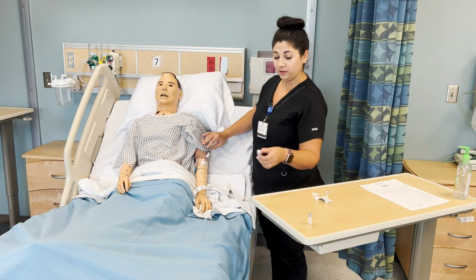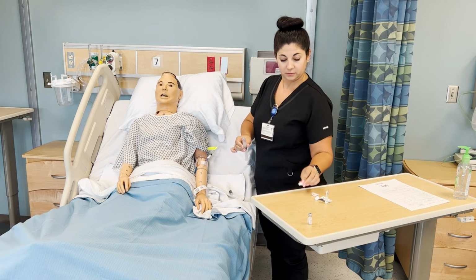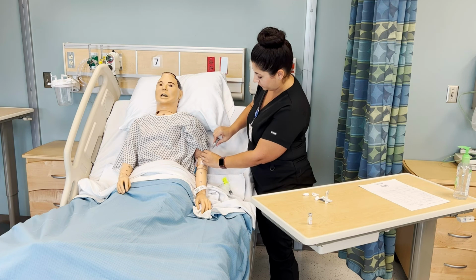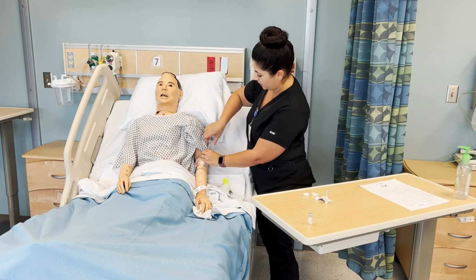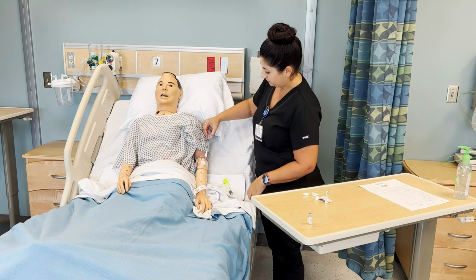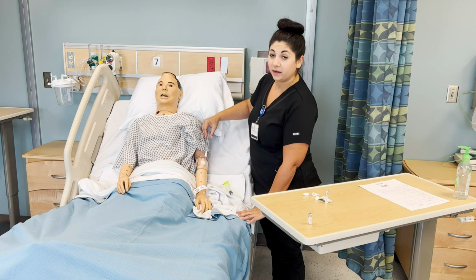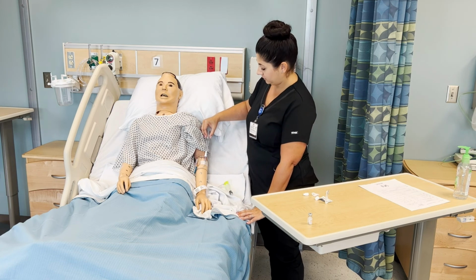Once that is all in, you will do a post flush with the first milliliter at the same rate that you gave your medications. And then at least 3 milliliters after that.